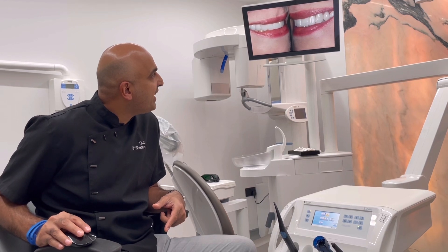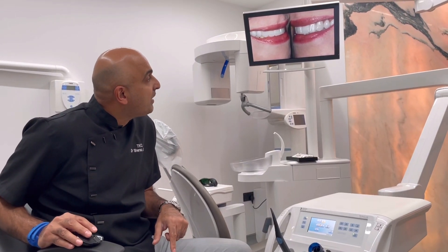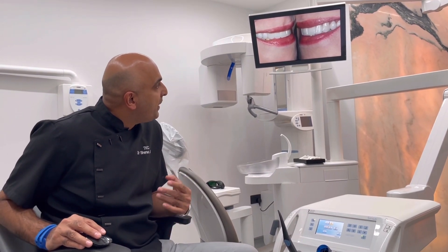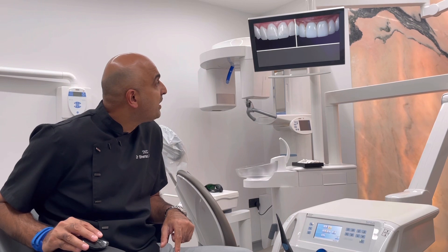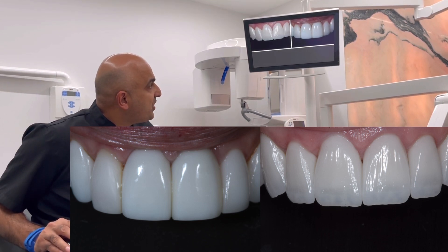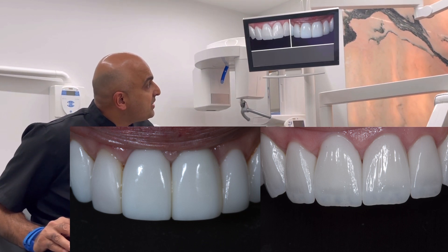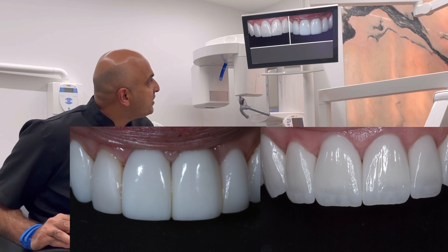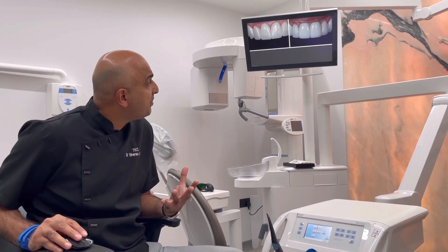Of course we'd love to also change that remaining old veneer, but at this point she hasn't decided to do that, perhaps for financial reasons. In an ideal world I'd love to change those, but the smile design overall is really nice, albeit slightly long. Taking these veneers off was a dream — we just used the laser and they pinged off, brilliant. Looking at the close-up, you can see the old piano-keys teeth were really unattractive, and one tooth was even wider than the other — the width was uneven, which is really bad design. We managed to get them identical, with loads of texture; the margins are beautiful, the gum lines are really nice, and we replaced all six veneers without having to change much of the underlying teeth.